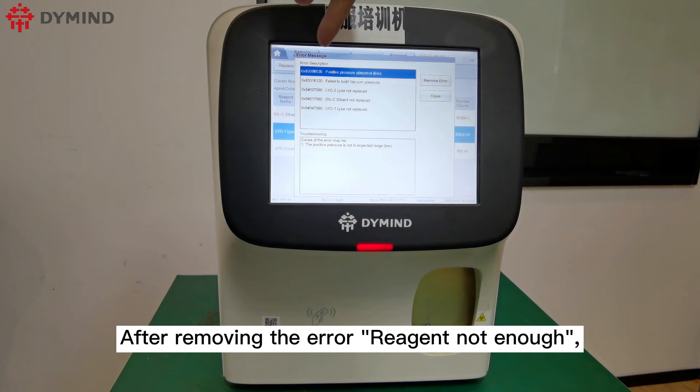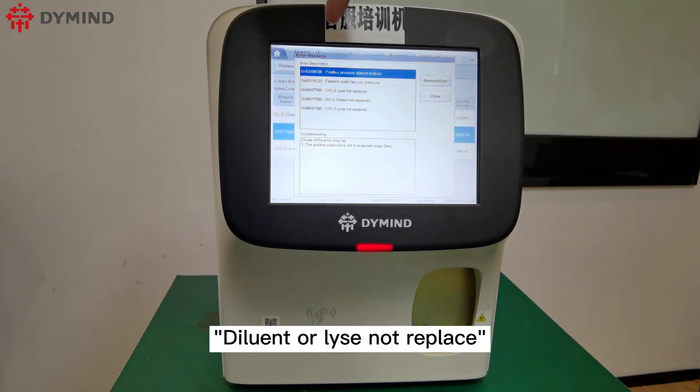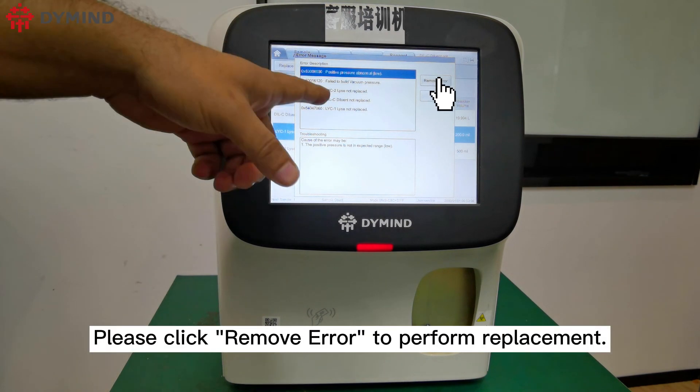After removing the error for reagent not enough, it will jump out another error message: diluent or lyse not replaced. Please click Remove Error to perform replacement.